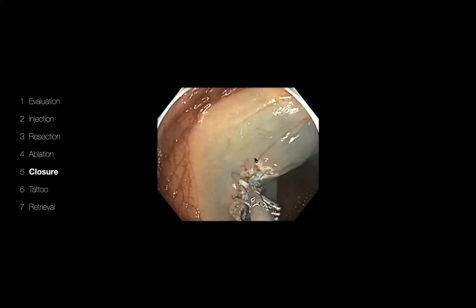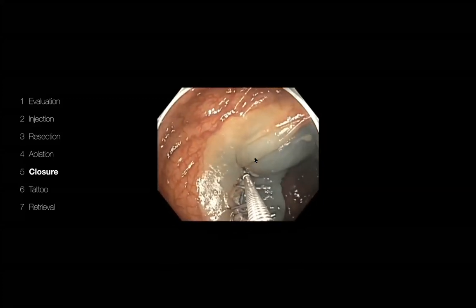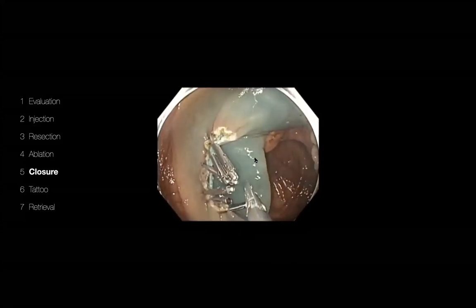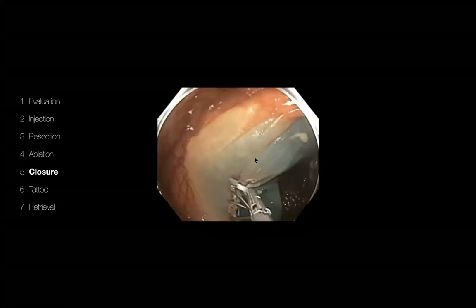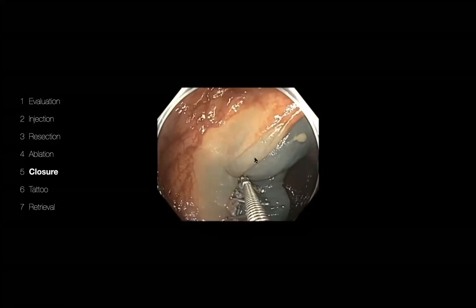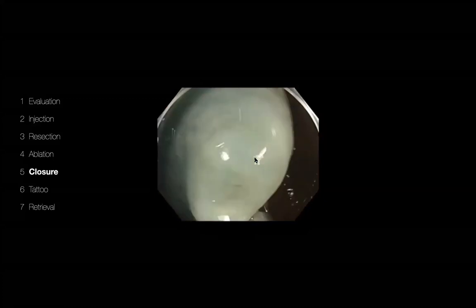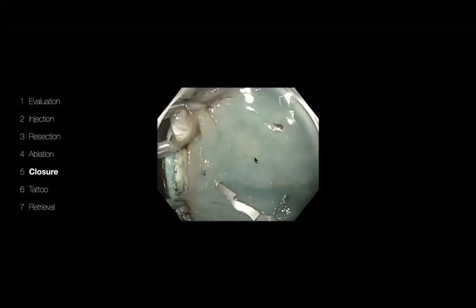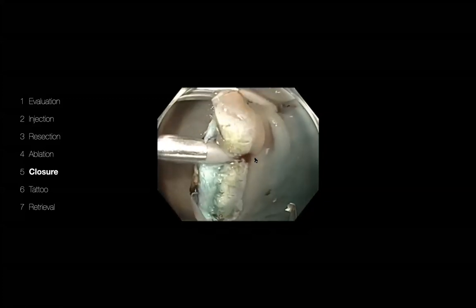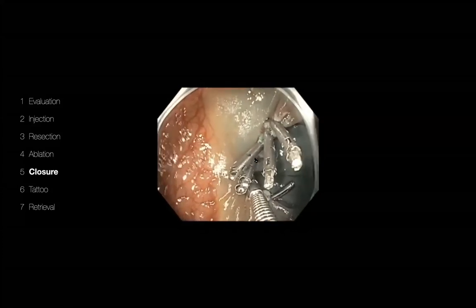The other thing you have to keep in mind is, if you look back, this is a patient who came for screening colonoscopy, and we found this large polyp. We felt it was a good idea to take it out, but you have to keep in mind that when you attempt this at the beginning of your day, you would run late, and your patients that are waiting for you may get a little bit upset. So something to keep in mind.